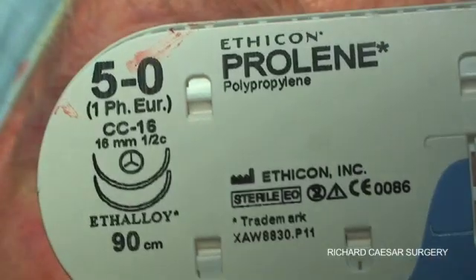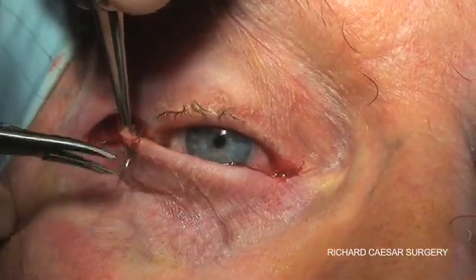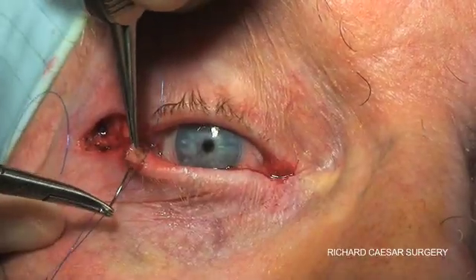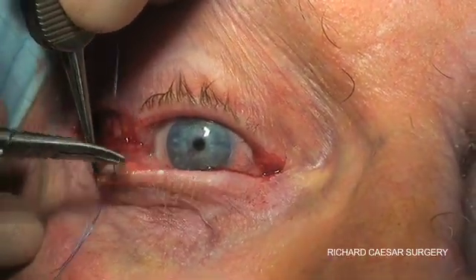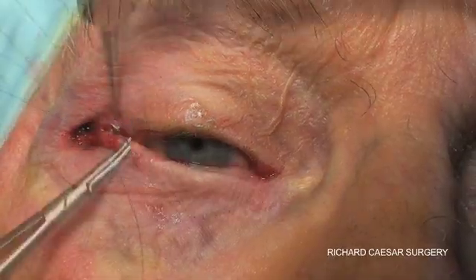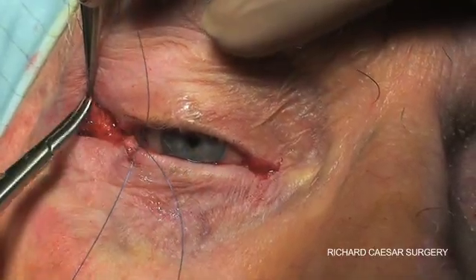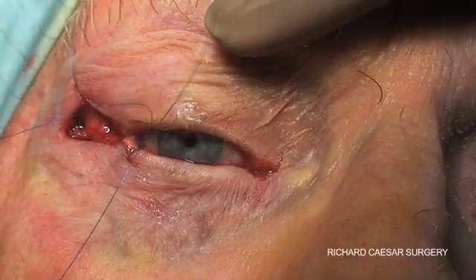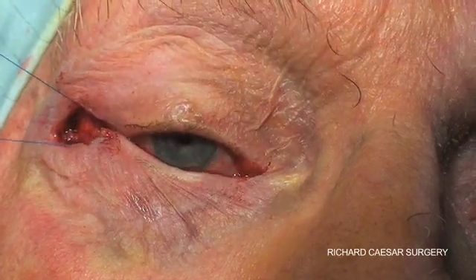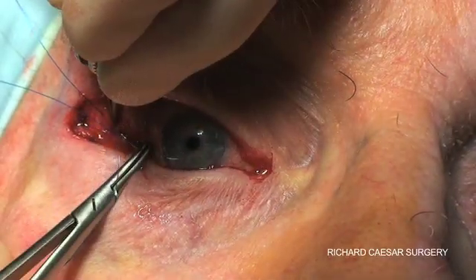The strip is then sutured to the rim using a double-armed 5-0 proline. These sutures pass initially from anterior to posterior at the upper border of the tarsal strip and then again from anterior to posterior at the lower border of the tarsal strip. The needle is then passed from the inside of the rim outwards — I pass the superior one first, followed by the inferior. The guide is that you're following the curve of the lower lid upwards towards the rim, which should put the lateral canthus at the right position.